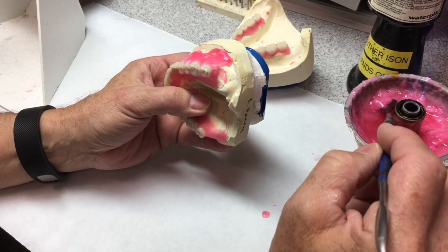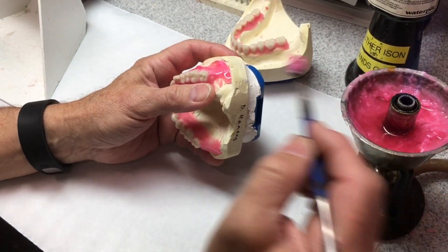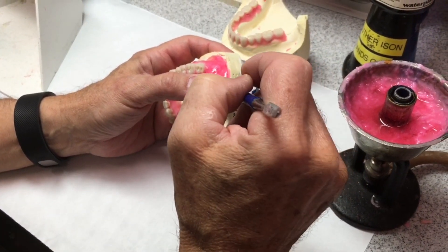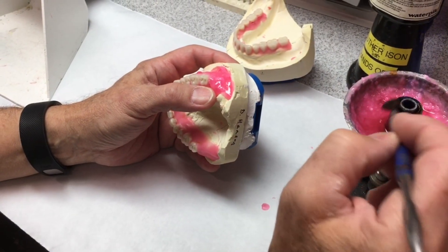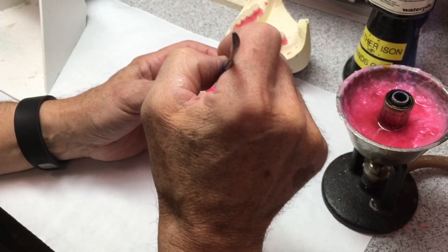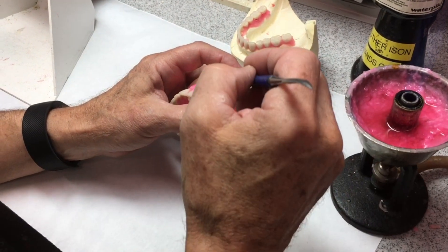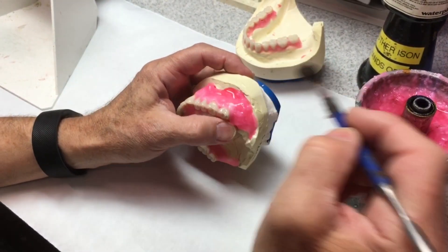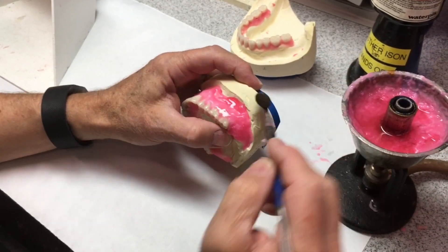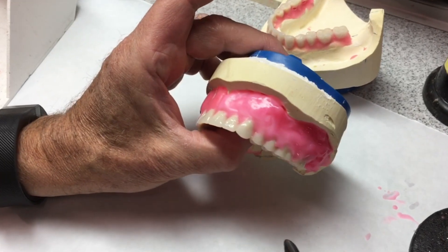I can flame it with the alcohol torch a little bit just to blend things together before I start carving it. Later, I'm going to put a preformed palate in this one rather than just a sheet of base plate wax. It's an immediate and the patient has not been wearing anything, so they would not object to feeling some rugae up there. I want to be sure and fill all these peripheries.